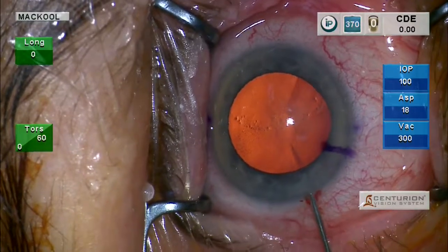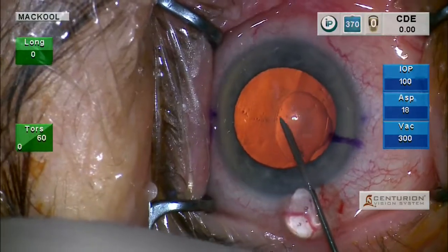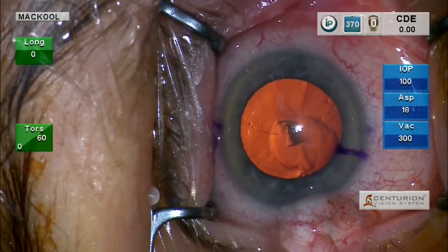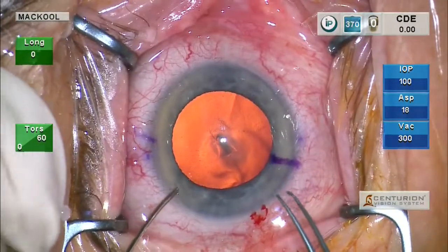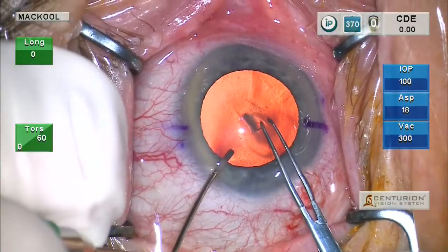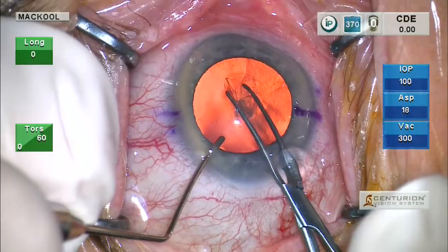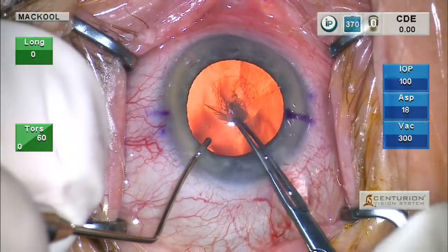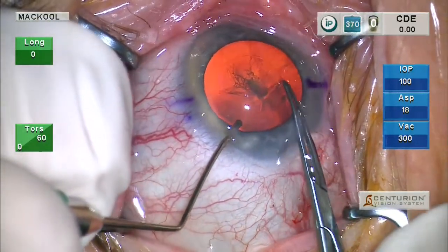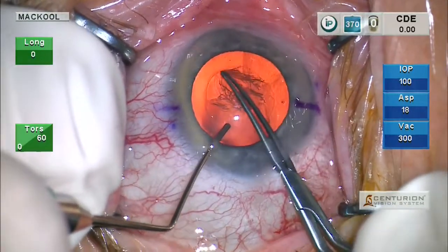So we filled the eye with Visco. Now I'm putting in some Provisc, and I'm going to incise the anterior capsule as you just saw me do there. And now I'm going to position the globe with the side port instrument and perform the capsulorhexis. What I'm doing is I'm just following the pupillary margin. So I get a fairly uniform capsulorhexis there.